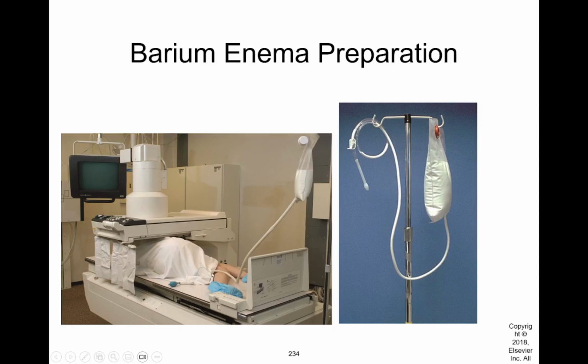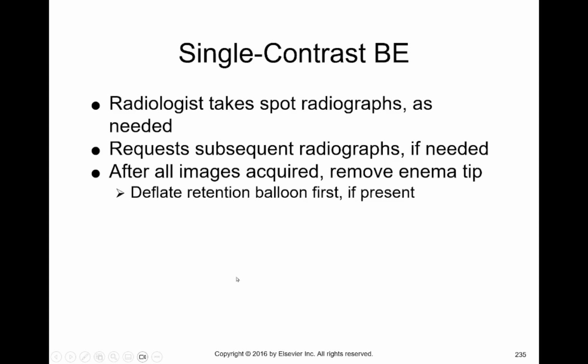It's a little uncomfortable, not really physically uncomfortable, but in a violation of my space kind of way, to get up under the patient's sheets to try to turn the barium on and barium off, and it's just not convenient, it's not ergonomic. So move it down here somewhere so that you can get to it whenever you need to.